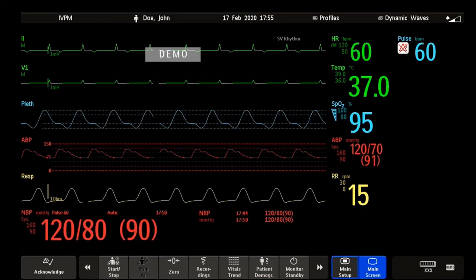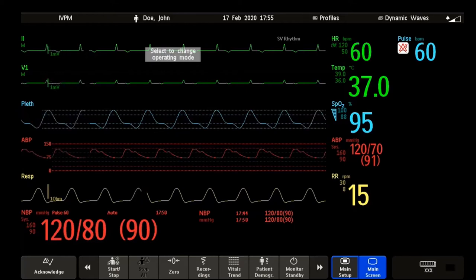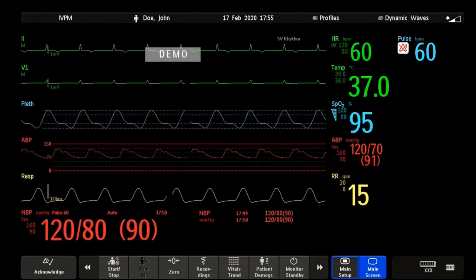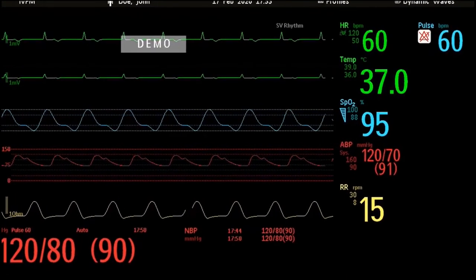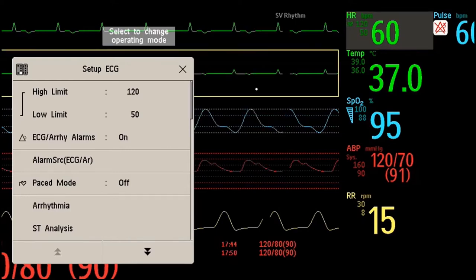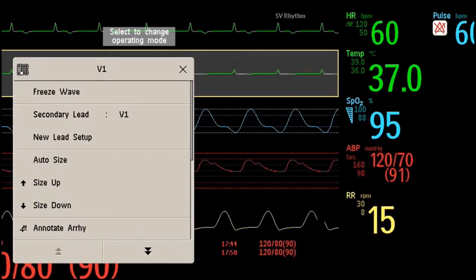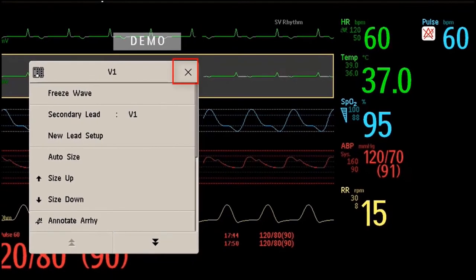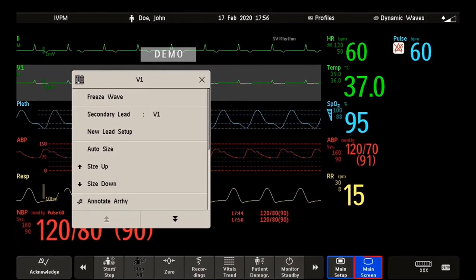Now that you know all the different screen areas, it is time to discover how you can operate on the screen. It's a touch screen — directly select the screen element you need. For example, select the heart rate numeric to call up the ECG setup menu, or select the ECG wave segment to call up the ECG lead menu. To close the menu, you can use either the X on the top right corner of the window, or you can use the main screen key below your screen.